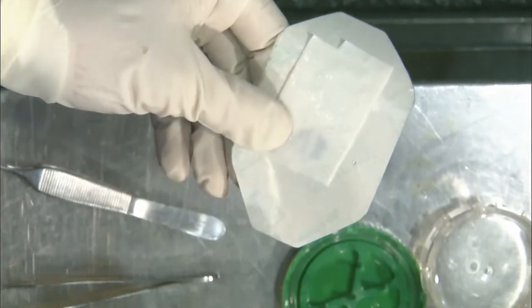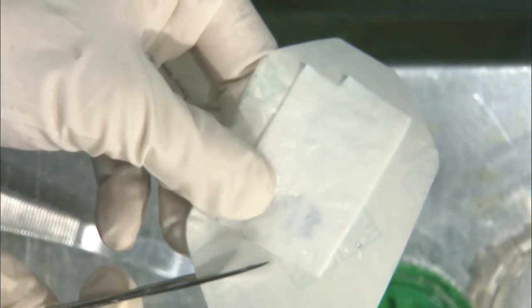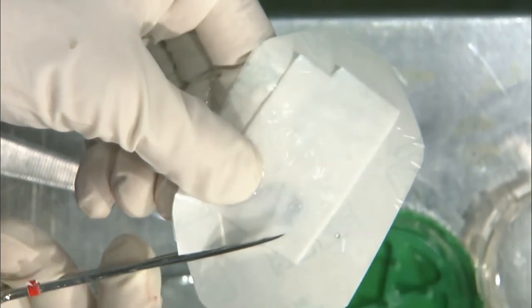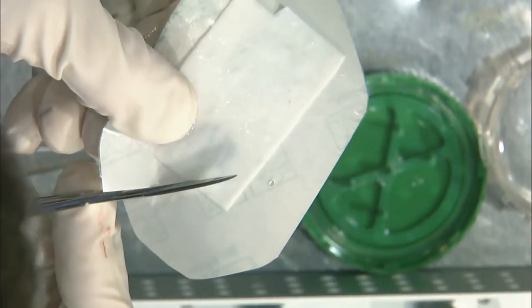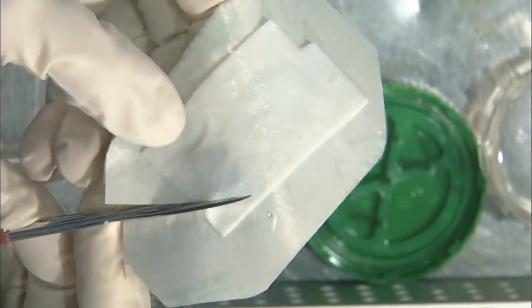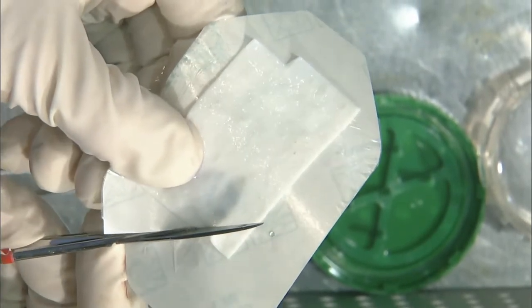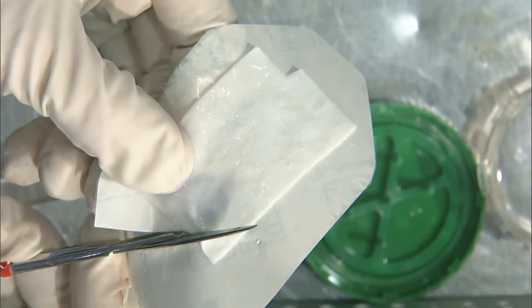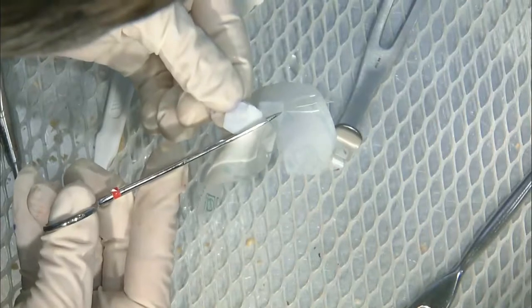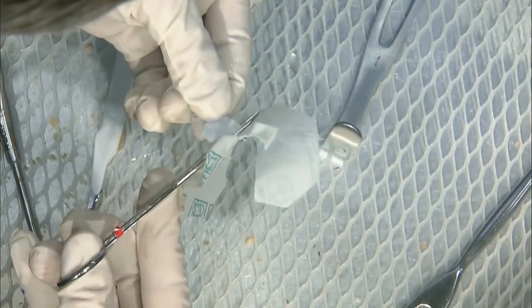Yeah, so that's great. As you're cutting that and working on it, something else you're going to want to do is take the rest of the fluid that the implant came in and have that on the back table, usually in a specimen cup lid, so that you can put the rest of the implant in there as you're implanting it, just in case it dislodges or you have any issues. This is always a little bit of a tricky part. So again, barely touching it.